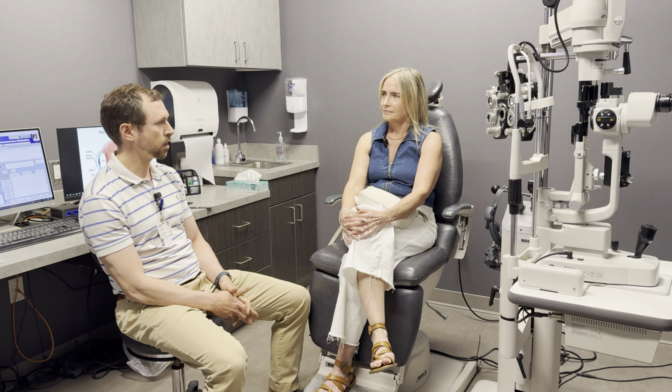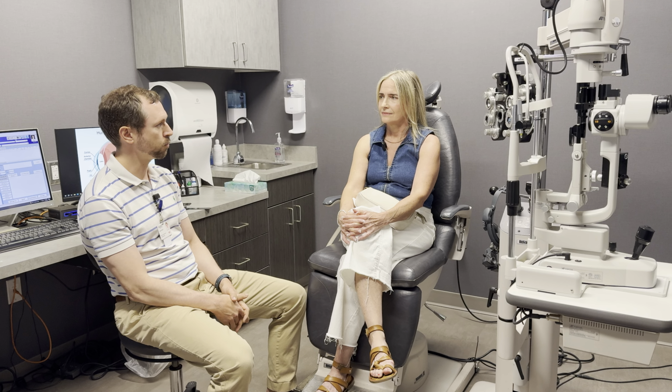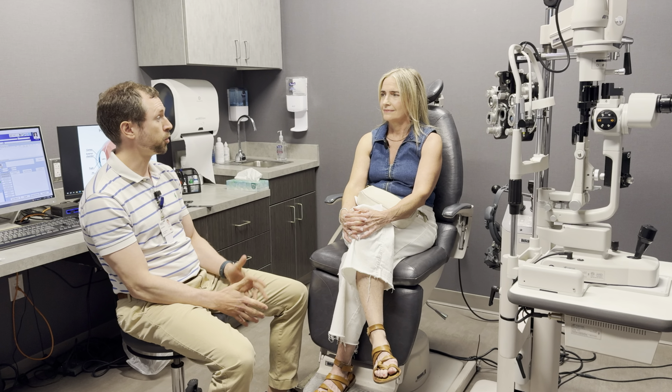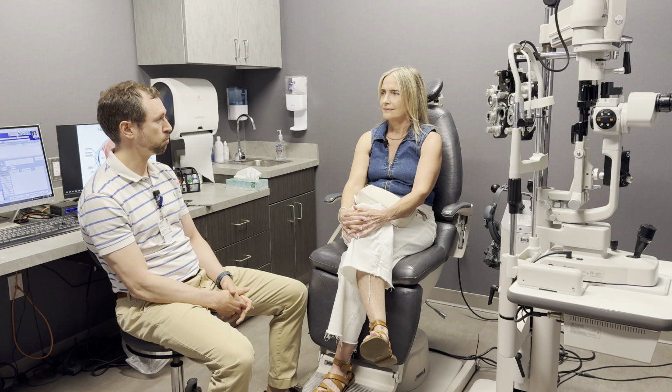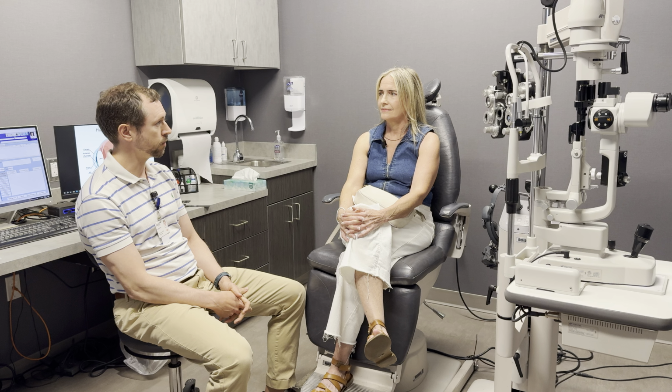Right. So we had you come out of your contacts for a little while and let your eyes breathe for a few days or weeks or so, and we got really good measurements on you, did multiple measurements and did good post-RK calculations, and went for it with an Odyssey multifocal.